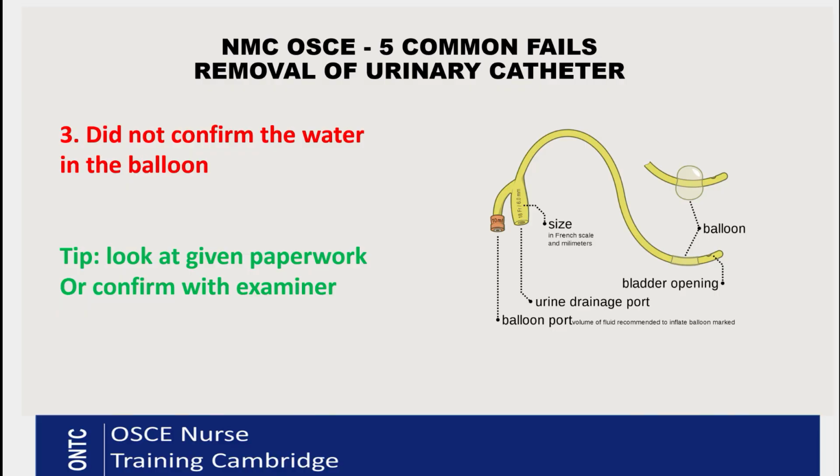Okay, number 3 is did not confirm the water in the balloon. So when the catheter is inserted, we always inflate the balloon with sterile water. Now, different catheters can have different size balloons. Most common is 10 mils, and in your exam that's what you get, but you do need to check.